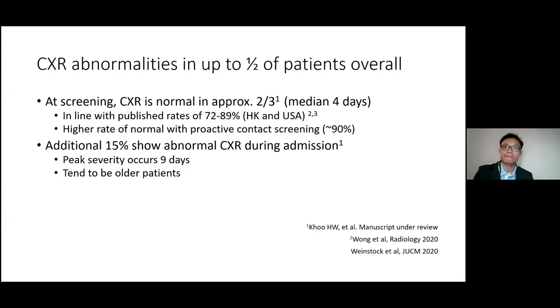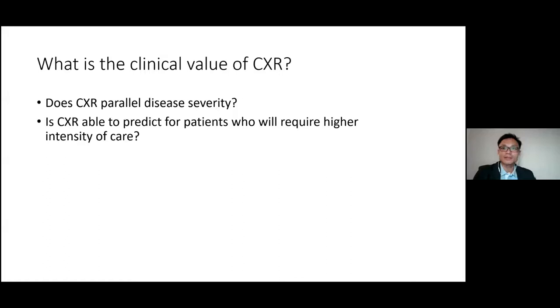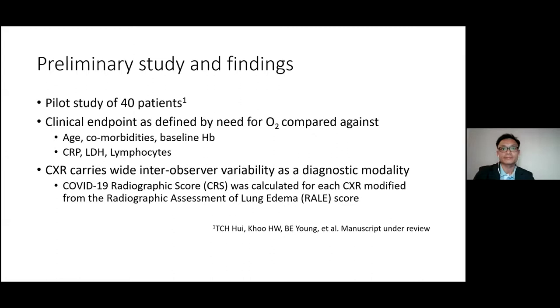So given the limitations of imaging described, and in particular for chest X-ray, a low sensitivity for diagnosis, what is the clinical value for chest X-ray? To answer this, we looked at two features. First, does chest X-ray severity parallel disease severity such that we can use chest X-ray to monitor disease? And secondly, is chest X-ray able to predict for patients who will require higher intensity of care? In our pilot study, which we have since validated against a larger cohort, we looked at supplemental oxygen requirement as a clinical endpoint and compared it against the clinical and lab characteristics of each group.